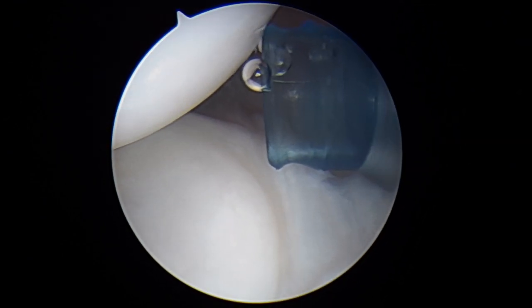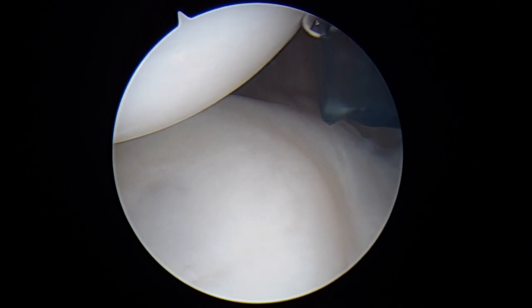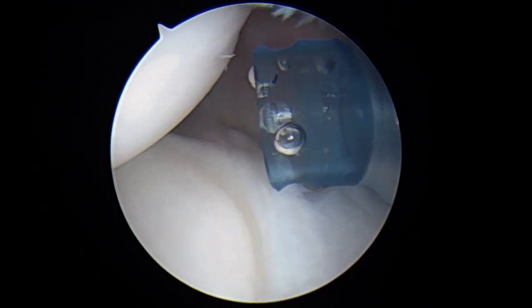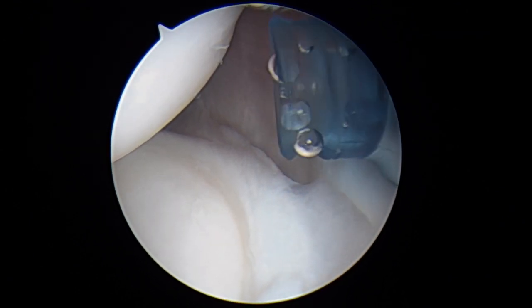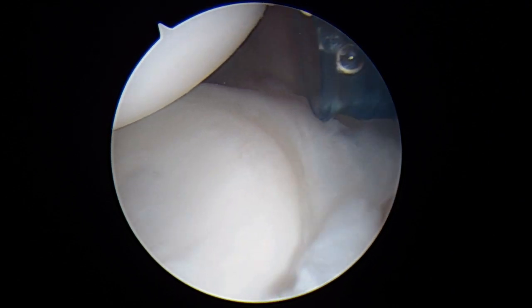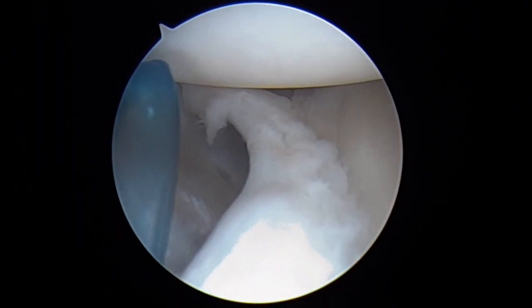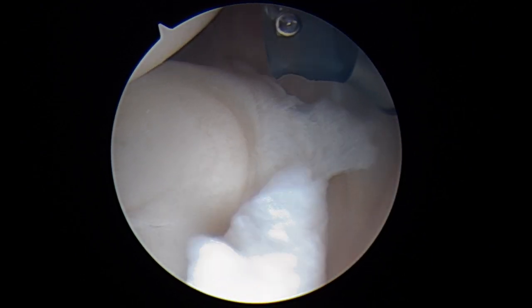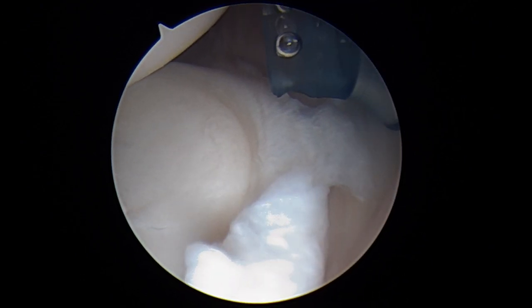Hi, it's Dr. Buford. We're just getting started on your right shoulder. We're looking in from the front to the back. This blue cannula you see is coming in the back of your shoulder. We examined your shoulder before we started and we found that there was some laxity. I couldn't get you to stay dislocated, but there's absolutely some laxity and that's why we're here.